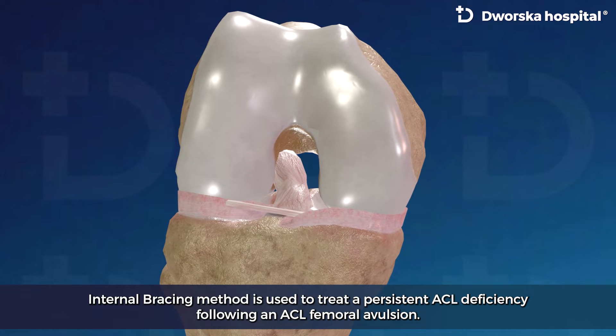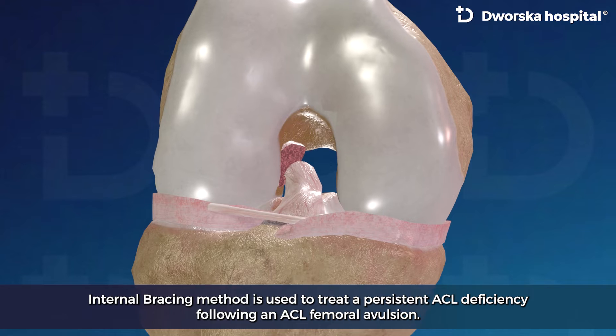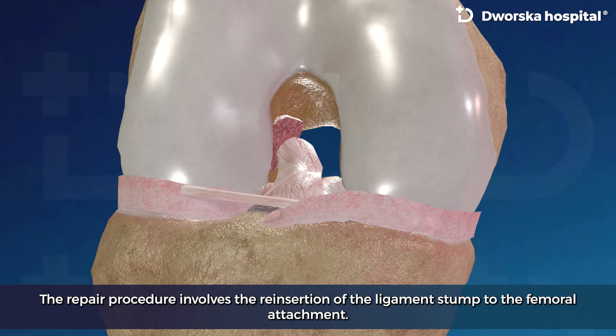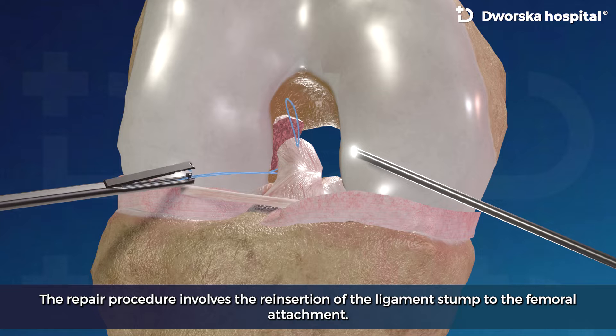The Internal Bracing method is used to treat a persistent ACL deficiency following an ACL femoral avulsion. The repair procedure involves the reinsertion of the ligament stump to the femoral attachment.